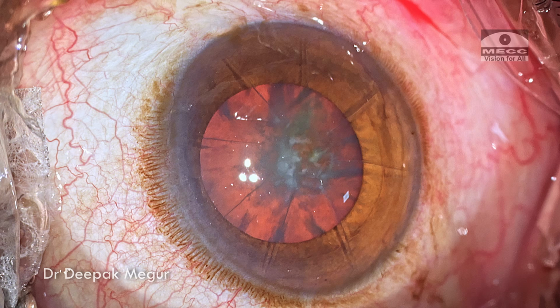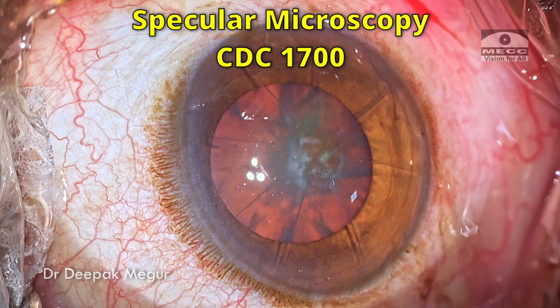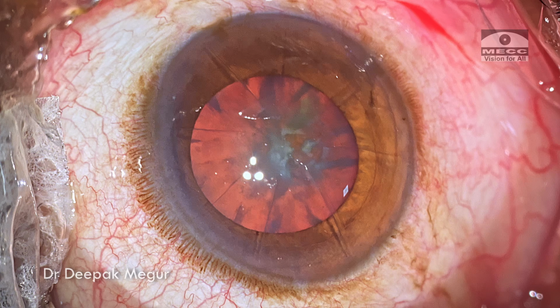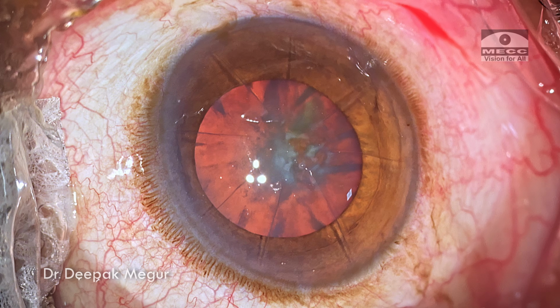We also did a specular microscopy of this patient, and the patient did show a slightly lower level of endothelial cell counts, and this also had to be taken into account when I'm performing the surgery. That is to ensure that the turbulence inside the chamber is minimal so that the endothelium can be protected.